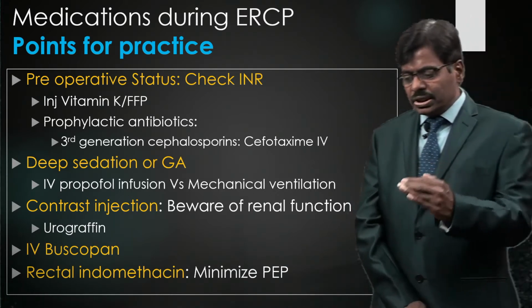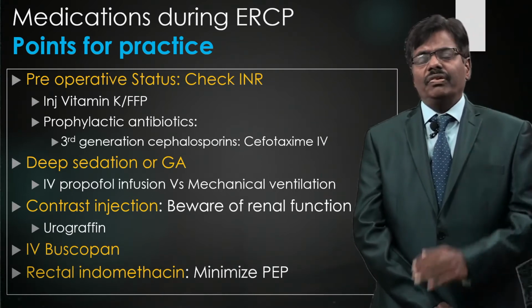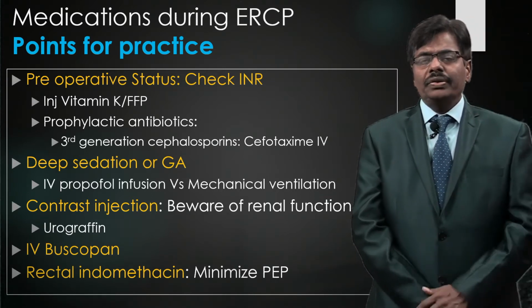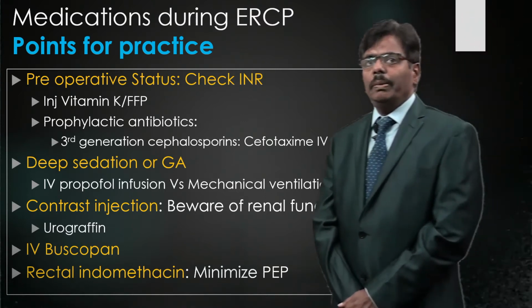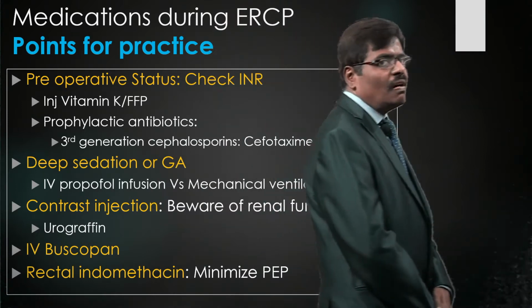So short general anesthesia, especially with a tube in place, gives you a lot of comfort for you to go ahead and do the cannulation. The cannulation rate definitely is going to be better in your beginning. Next important injection, of course, is the contrast.